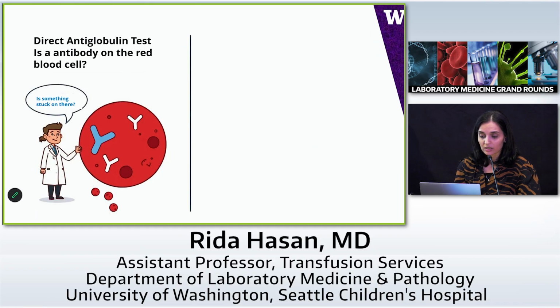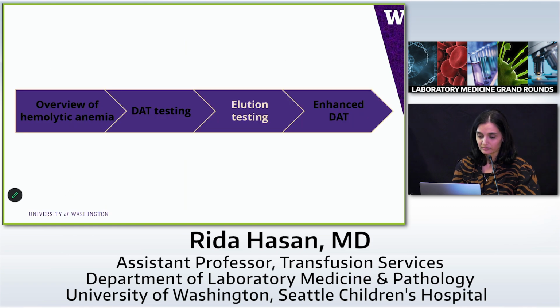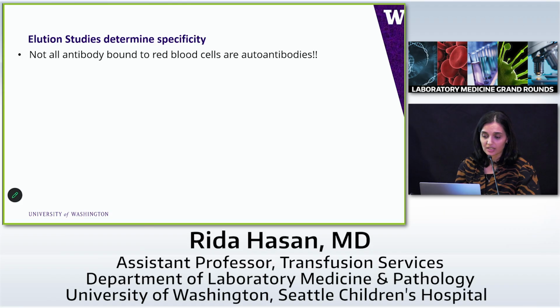And now we're going from being laboratory scientists to really being detectives. So what antibody is it? I know there is something, but I want to know exactly what it is. Now we'll talk about elution testing, and elution testing is helpful because it determines the specificity.